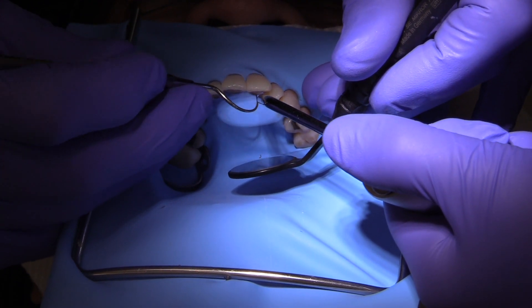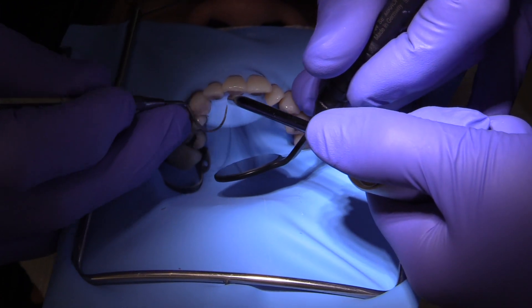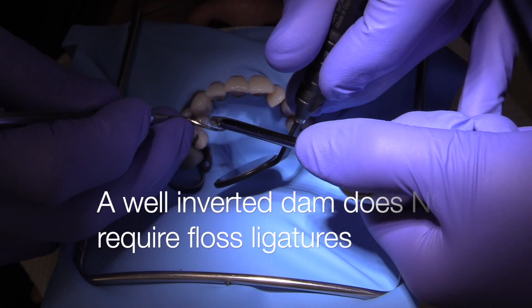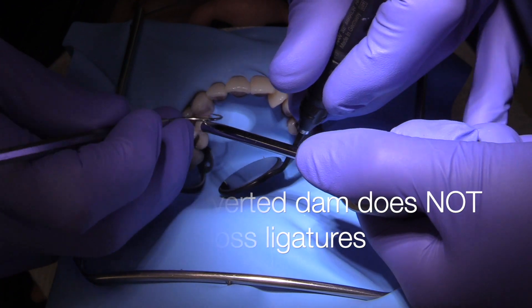I think that probably one of the most beneficial steps you can take is to carefully invert the rubber dam in every area, both on the facial and lingual.